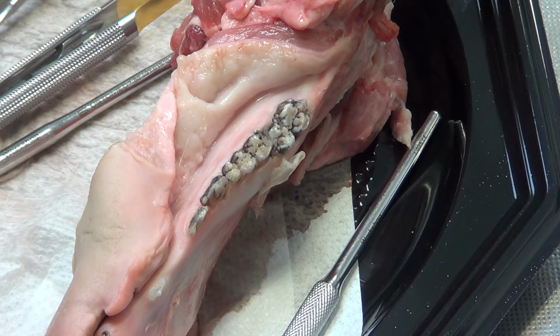But be aware not to cut the periosteum, because remember, at the end we need to suture this periosteum to obtain the apicalization of the mucosa. So the needle, as you can see, goes down under the periosteum. Here you can see perfectly, and only with this type of suture you can fix the mucosa in the apical zone.